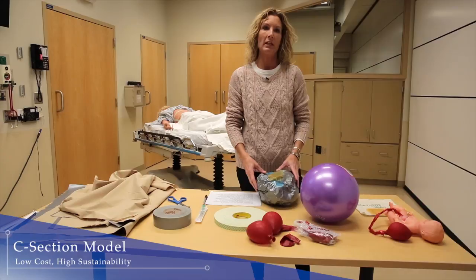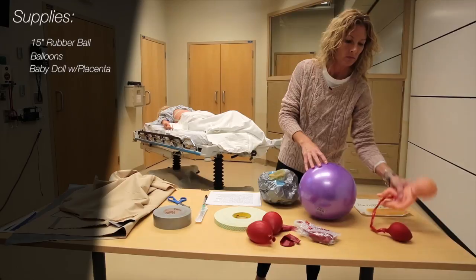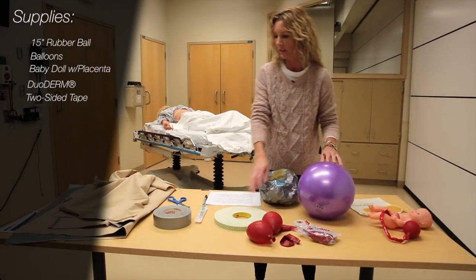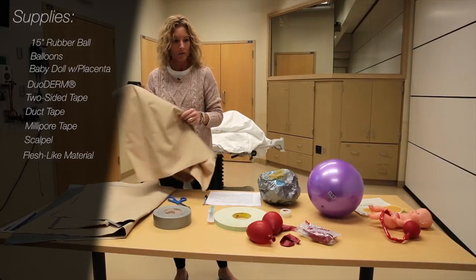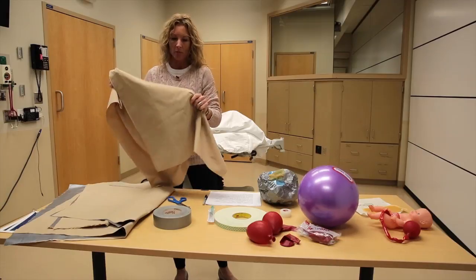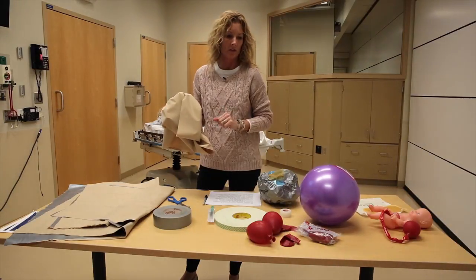This model was originally built for emergency medicine residents to use in a perimortem C-section case. To begin, you need to get your supplies. I used a 15-inch rubber ball, balloons, a baby doll with a placenta. You'll need some duoderm or a similar product, two-sided tape, duct tape, millipore tape, and a scalpel. You'll also need some flesh-colored material — all of these items were bought at a discount store, something like a tablecloth or shower curtain. I purchased two yards of material and cut it into four pieces. I was able to do four models with the supplies I bought, and the total cost was no more than $16.